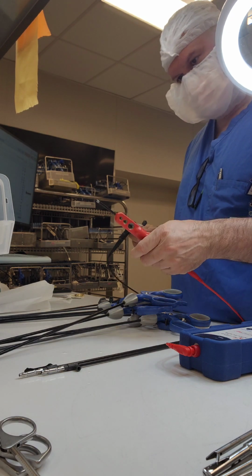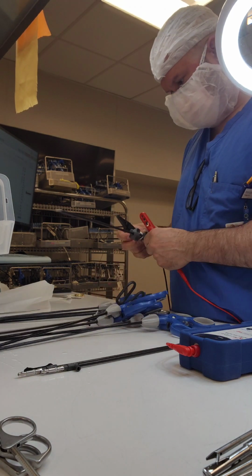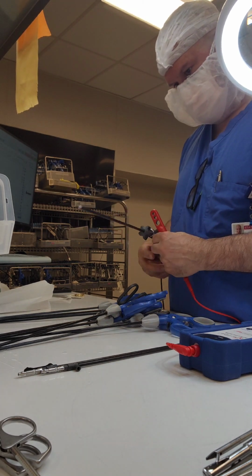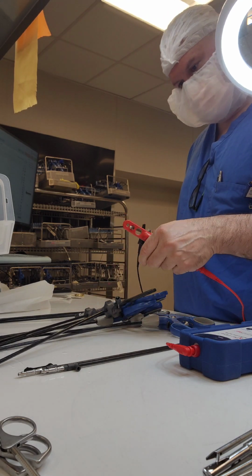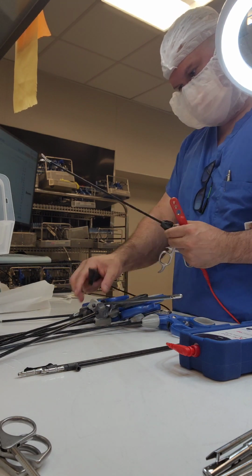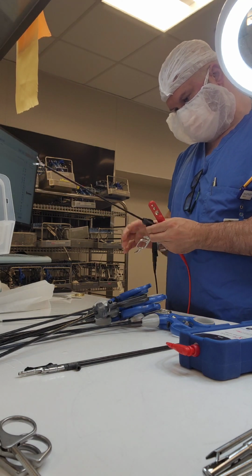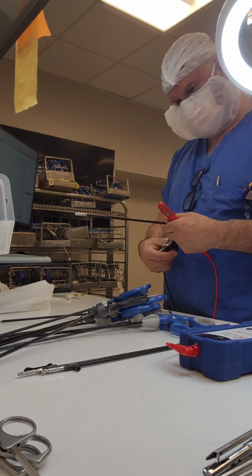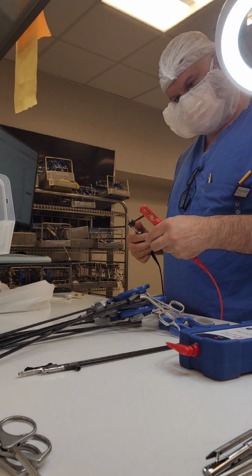So our job in sterile processing is all about the patient, but we serve the users. We have to look out for the users first. So when we're testing and assembling our instruments, it's to meet the user's needs. And an insulation test that fails at the base puts the user at risk. So we have to make sure that the whole instrument passes, not just the tip that enters the patient. That's not insulation testing, guys. All right, so continuing the testing here.